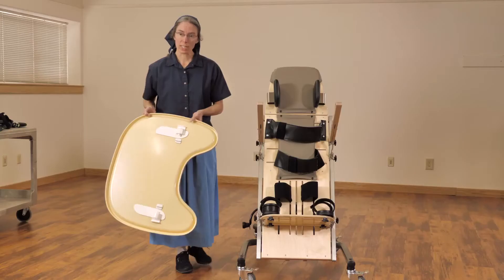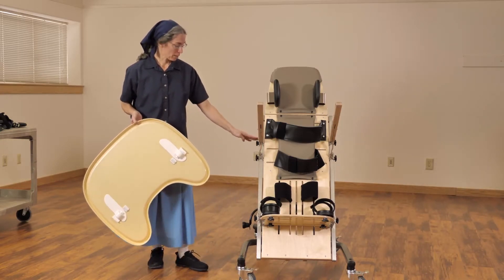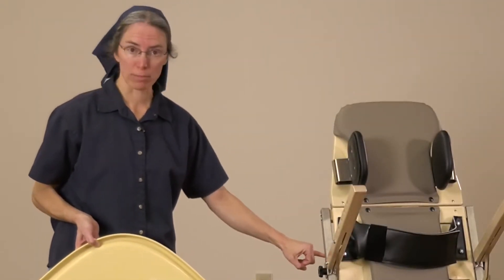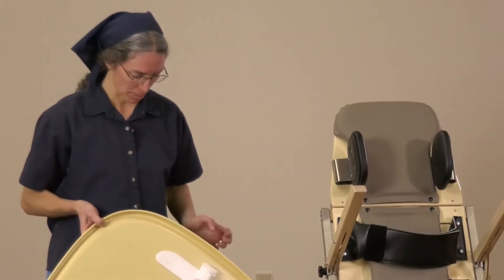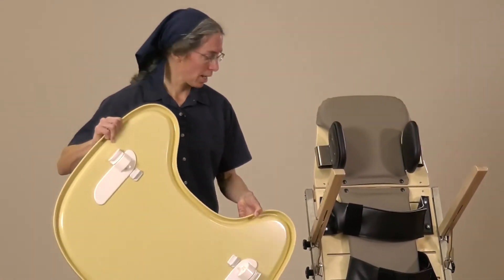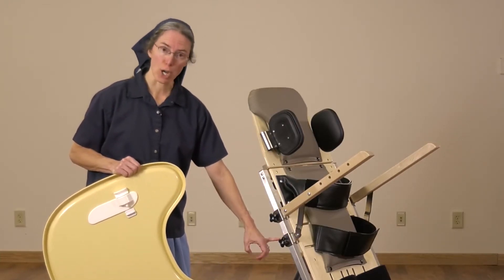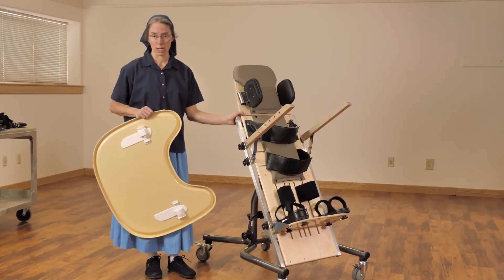One consideration with the tray for the supine stander is that you'll want the armrest to be equidistant from the top of the bar to the knob on both sides. You might even want to make a small marker notation for a particular student if that's important in a given case. To place the tray on, simply pull out the latch and secure it into the holes on the side. Once the tray is in place, you can do further adjustments with the lower knob to modify your angle as needed, depending on the position of the board of the supine stander.